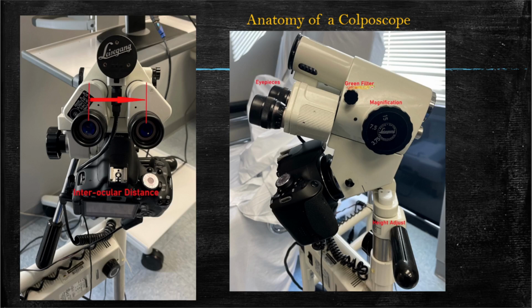We've got a green filter to look for vascular changes. We've got 3 settings here for magnification, and again, kind of a height adjustment there.